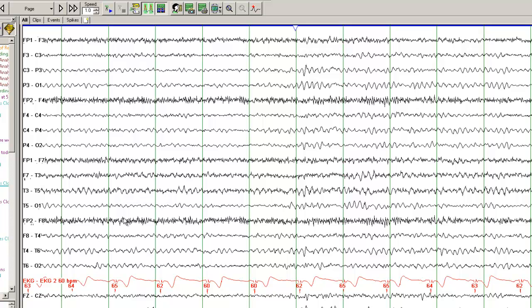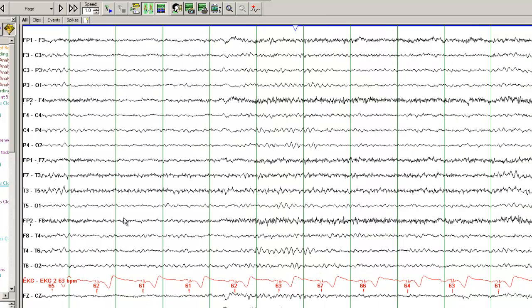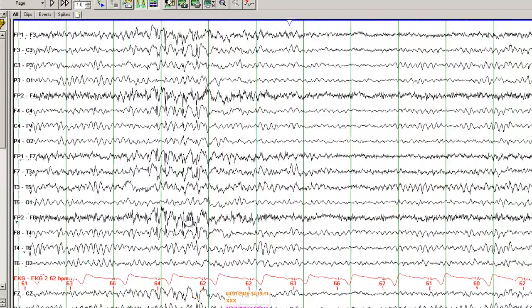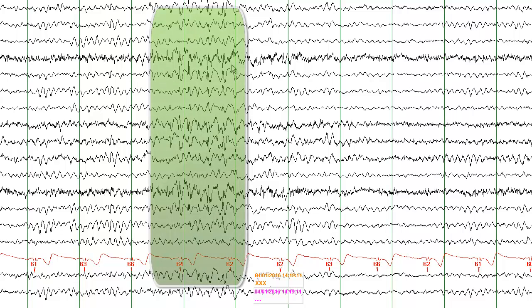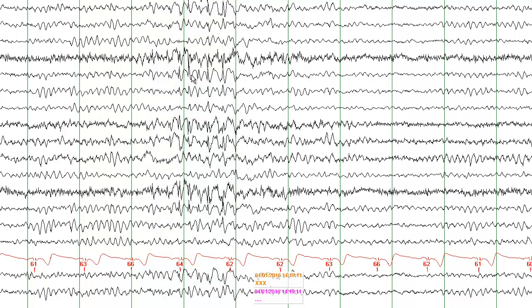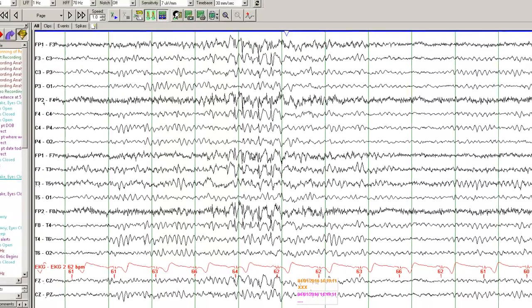Seizures can be provoked with sleep deprivation, seizures can be provoked with strobe lights. So here you see this another abnormality. This is spike in wave discharges, the frequency is a little higher. So this is one wave in a spike, another wave in a spike, three, four, five. So the frequency here is almost five to six per second spike in wave discharges.